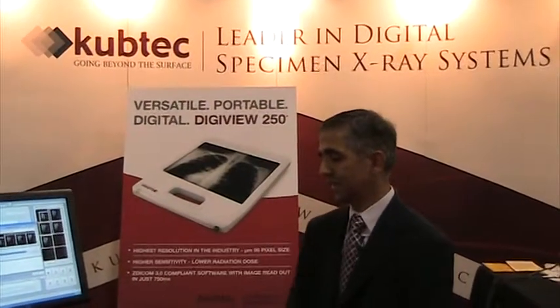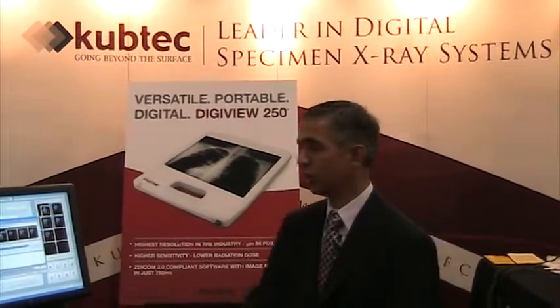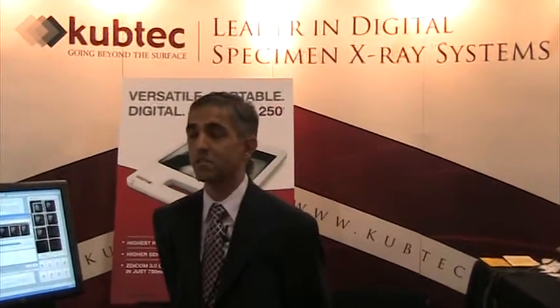Not only are these systems used for imaging breast tissue in radiology and in the OR, we have larger specimen x-ray systems now that are being used in pathology to image not only breast specimens but also larger excised tissue specimens. Thank you.